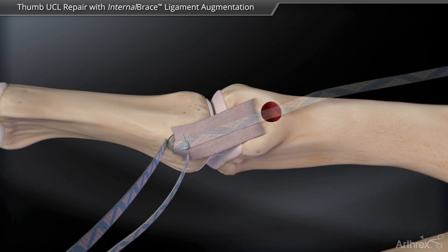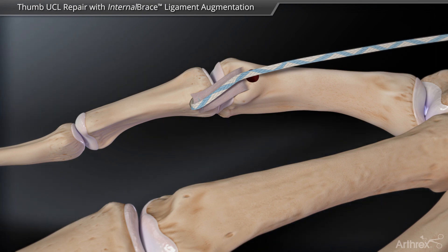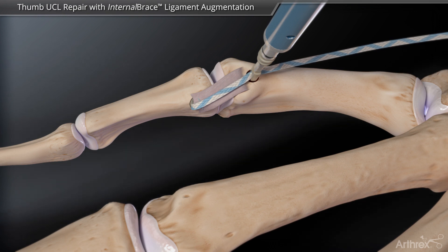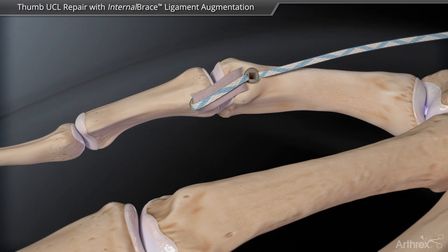The suture tape suture is brought over the ligament and the thumb is flexed 30 degrees. A second swivel lock anchor captures the suture tape and secures it in the metacarpal head, creating the internal brace augmentation. Any remaining suture is cut flush for an all-knotless repair.